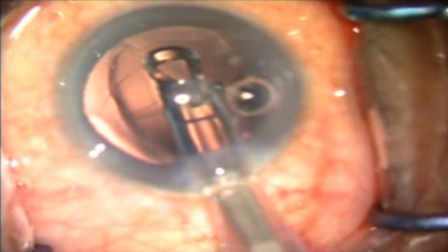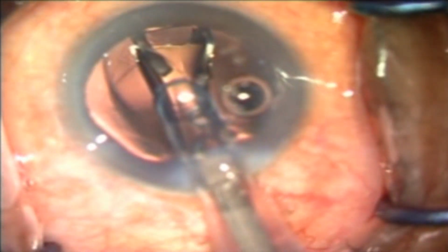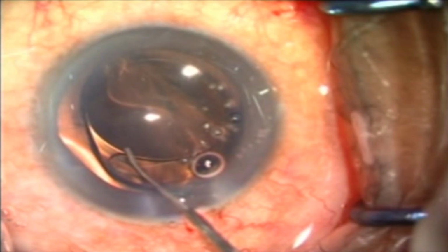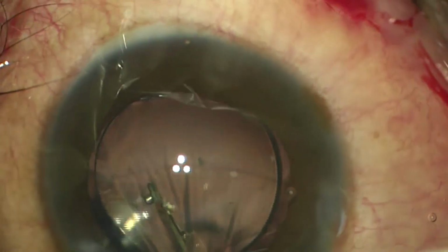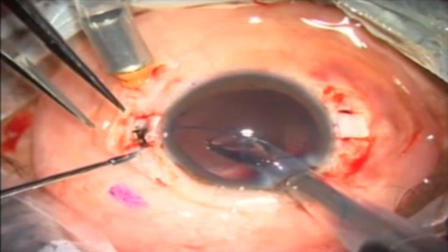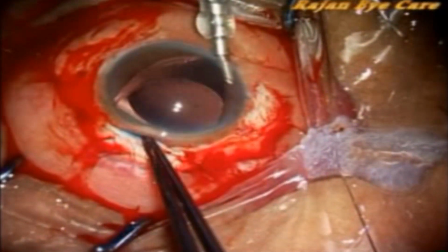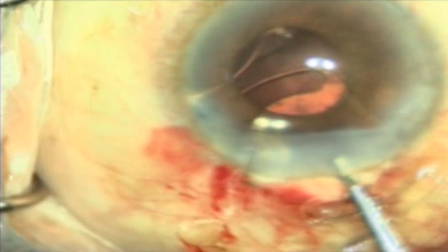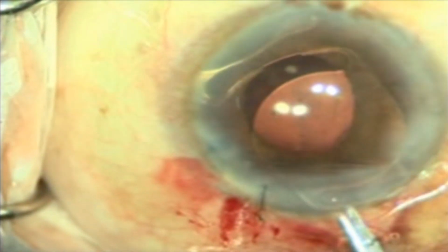Once you have managed the PC tear and the vitreous loss very competently and effectively, then if the PC tear is small, we can go ahead with the single piece lens in the bag. If the PC tear is large, then we have to go in for a multi-piece lens in the sulcus with an optic capture, or go for a retro-iris fixated lens, or a secondary or a primary glued IOL, or a sutured scleral fixation IOL, or even an anterior chamber IOL, making sure a peripheral iridectomy is done for patients with anterior chamber IOLs.